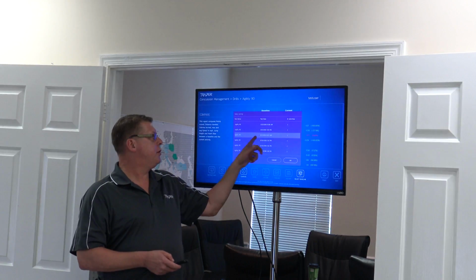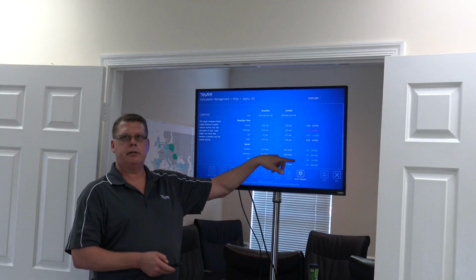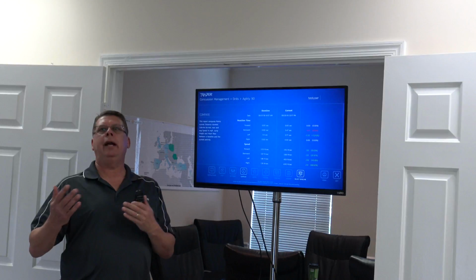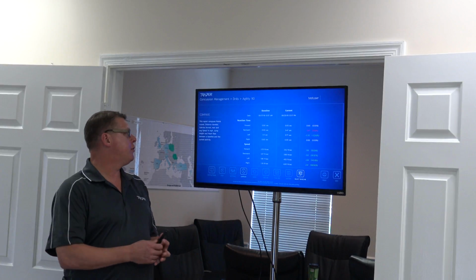So if you watch the numbers here, once I click that, these numbers are going to change. So you saw the change. So you can compare any previous point in time to the current point in time. In the cloud, you can go in and you can pull reports from any point in time and compare one report to another or multiple reports.